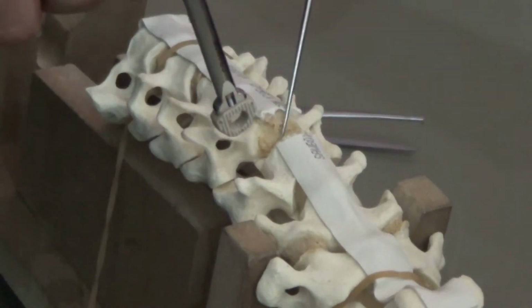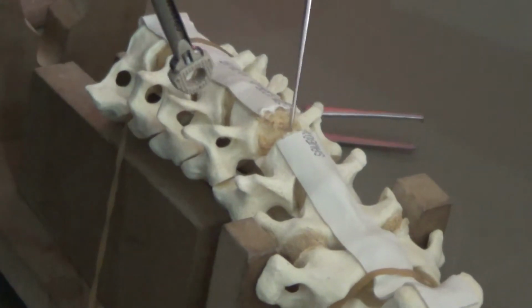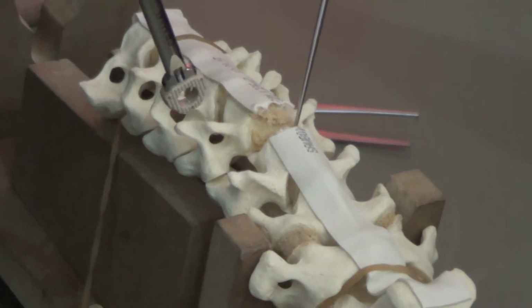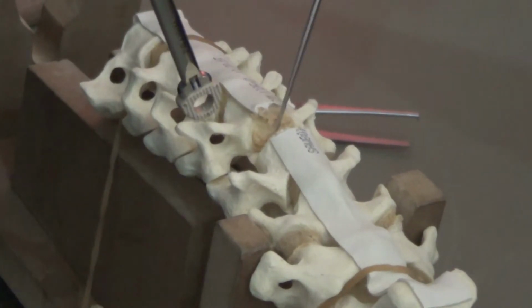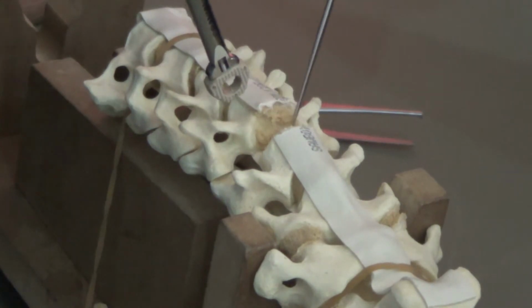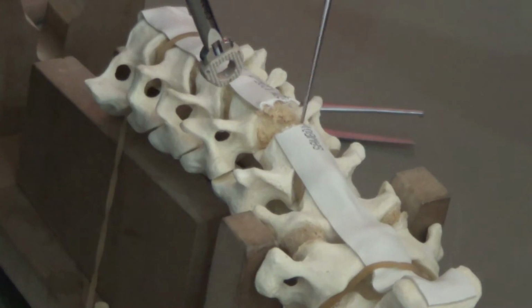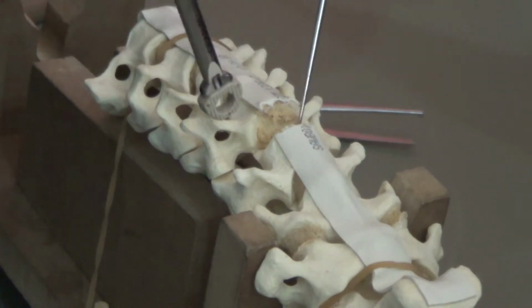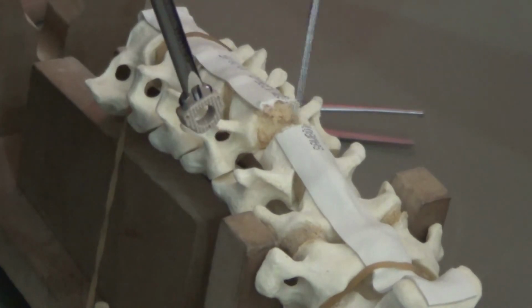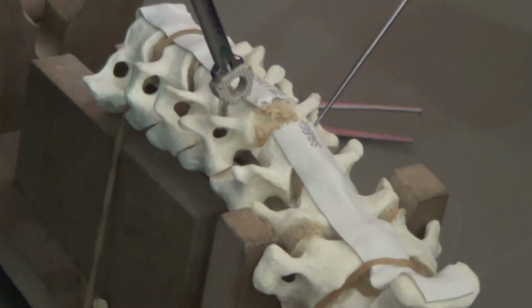You should be very careful to remove this because sometimes there remains some epidural vessel, and you can injure the epidural vessel. So centrally, if you go more posterior, you can damage the dura, and laterally you can damage the dura as well as the nerve root and epidural vessel. Sometimes huge bleeding may come. So you should be very, very careful when you are near this posterior longitudinal ligament and dura.